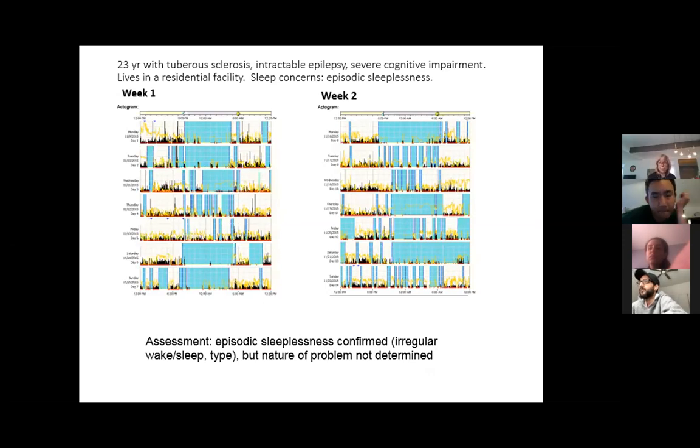It's like, no, I can't do a sleep study on her, because she had limited ability to cooperate with a procedure like that. But we did actigraphy. And I thought it was kind of interesting. The facility was right, but I'm not sure what I'm supposed to do with this person. I think the question from the neurologist is, when her seizures are really bad, is that when she sleeps a lot or is that when she's awake a lot?